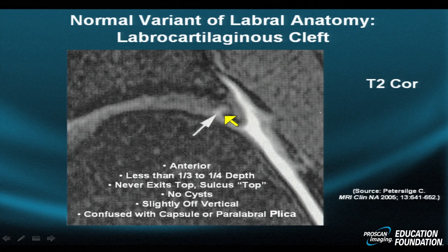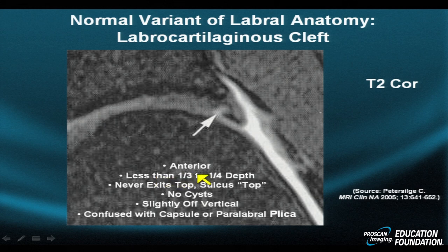One often sees a thin rim of fibrocartilaginous hypointensity around it. Not so in cases of traumatic labral tear. The traumatic labral tear is often more knife-blade-like, is associated with swelling, is often anterior, and is more than a third to a fourth of the depth of the labrum — often a half to three-quarters the depth. While the sulcus never exits the top, a true tear exits the top commonly.